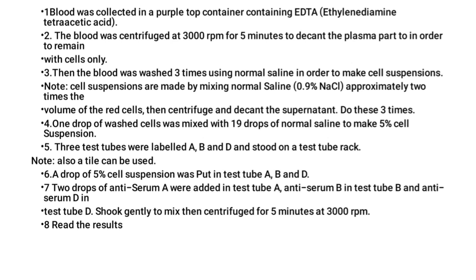For the test, get a drop of 5% cell suspension and place it into labeled tubes. You need three tubes: label them A, B, and D. In each tube, place a drop of cell suspension. Then add two drops of Antiserum A into tube A, two drops of Antiserum B into tube B, and two drops of Antiserum D into tube D. Then centrifuge the tubes.